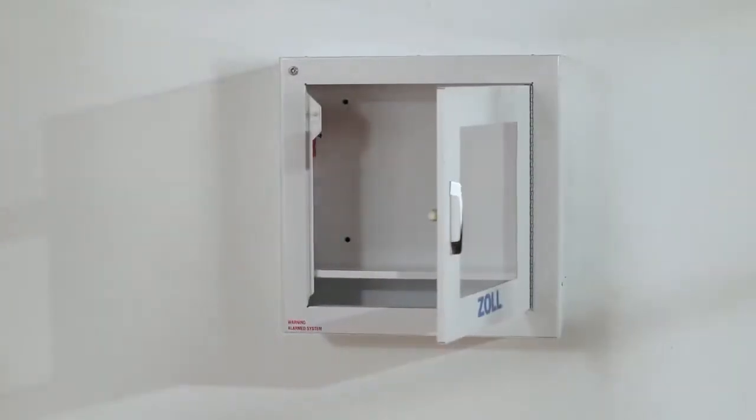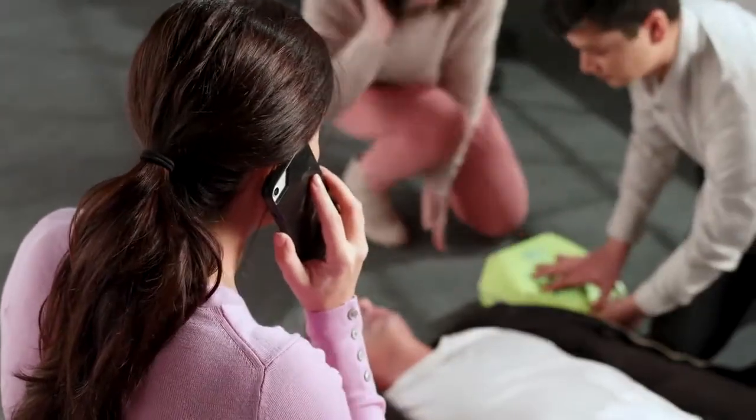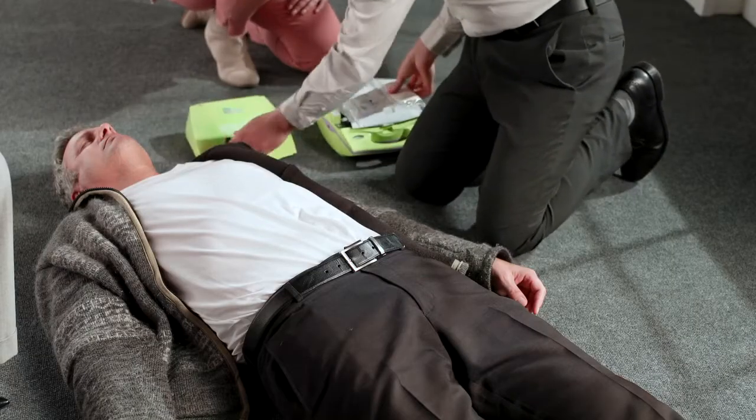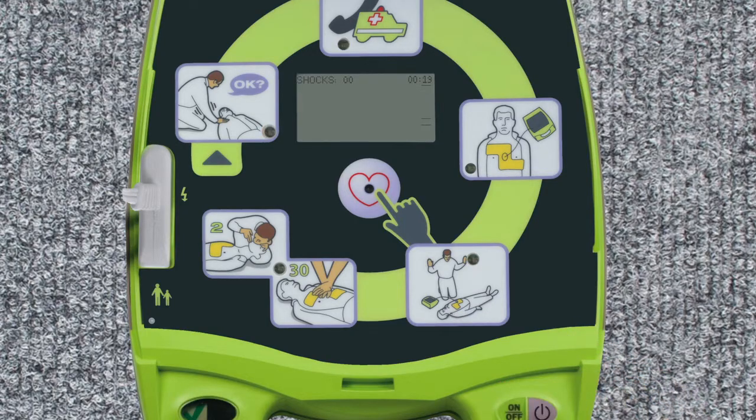Placement of the AED should allow for retrieval in three to four minutes. Place the AED next to the victim's shoulder. The AED provides both voice and text prompts, as well as graphic icons. Text prompts can be helpful in noisy environments, and icons are useful in multilingual environments.